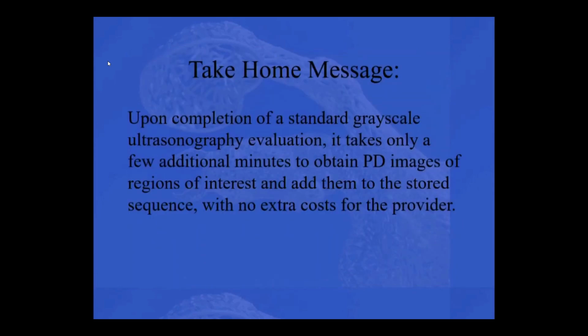My take-home message for today is that it's really easy to add this little technique on to your standard imaging technique. And if you do it a couple of times in sequence, it gives you a lot of extra information with, what's really important, no extra cost. I don't know if you want to charge the client for it, but to me this is a standard package they get. And when they go to another specialist and they don't see the color, their perception is that I'm more complete in my exam, so it helps me to sell my practice, let's say, in that way.